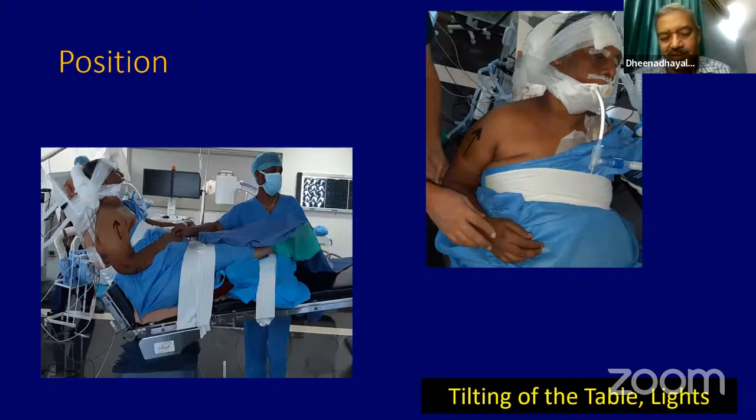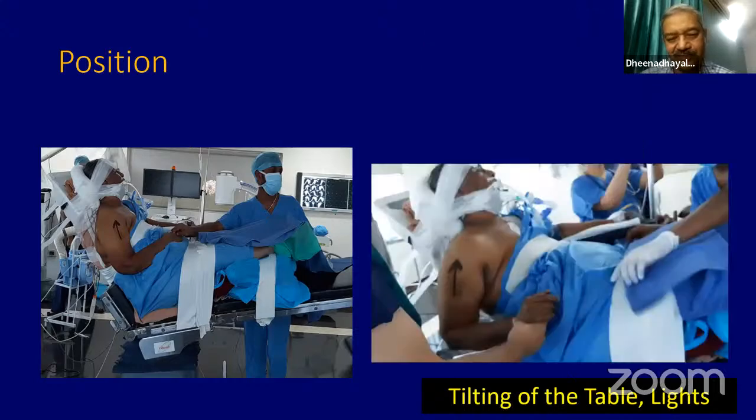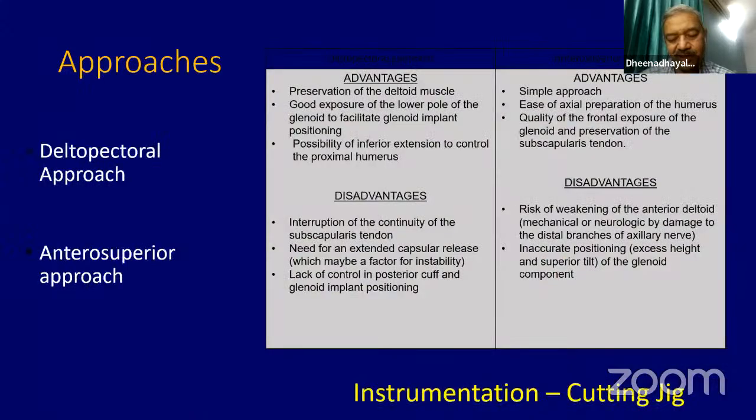Regarding position, you can do it in a supine position or in a beach chair position. What is important is that your arm must swing across — nicely swinging from flexion to extension at the side of the table. I make sure the patient is in beach chair position and tilt the table so the patient is tilted towards me. Every one of you must make sure that the lights are arranged very well during this procedure.